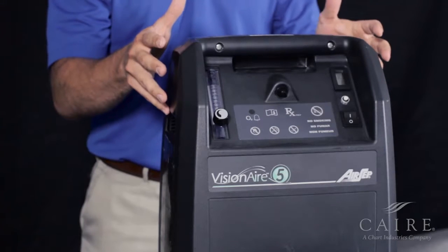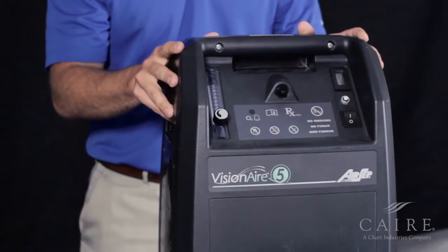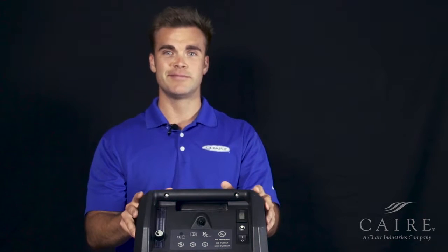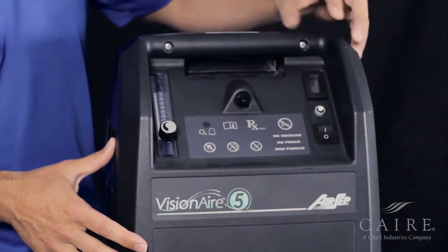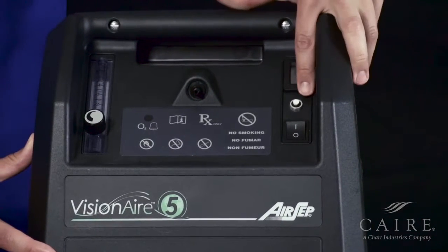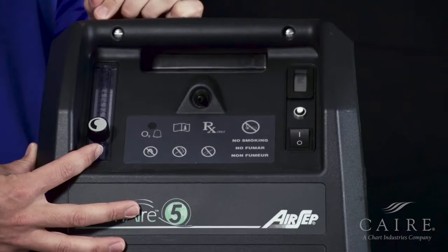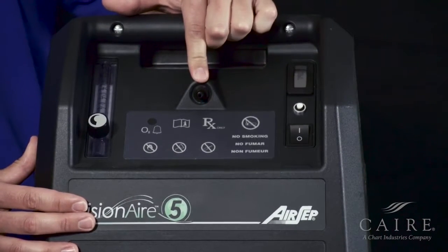First, we'll point out that you can hook up a cannula and go up to 50 feet in cannula length. So once you actually have the unit in the home, you can go ahead and plug it up. The first thing we're going to point out is a couple of different functions on the front. Over here in the top corner is going to be the hour meter. You have a reset button and the on-off switch. On the opposite side, just like any other concentrator, you're going to see the flow meter. And then in the middle is our plastic barb piece.